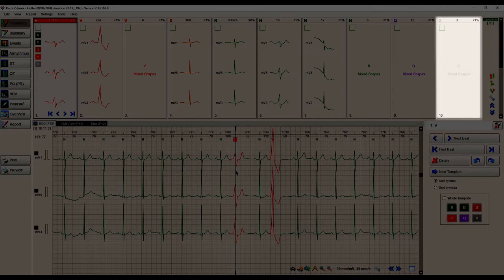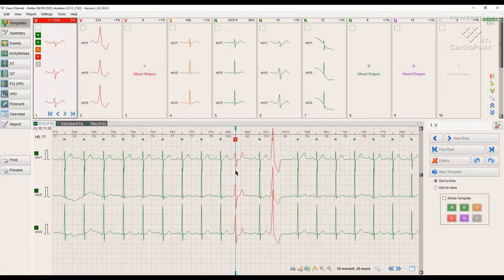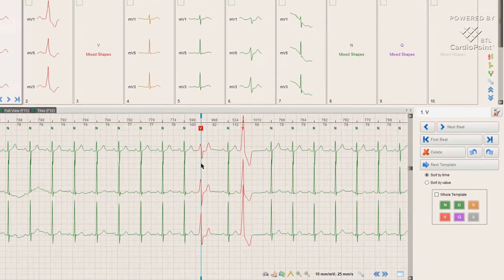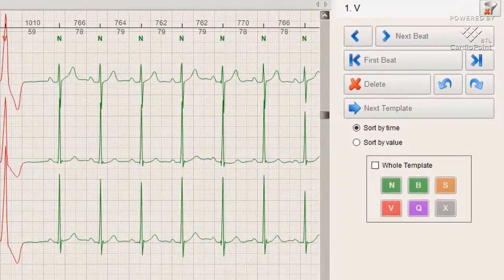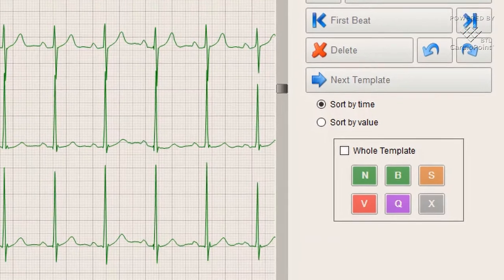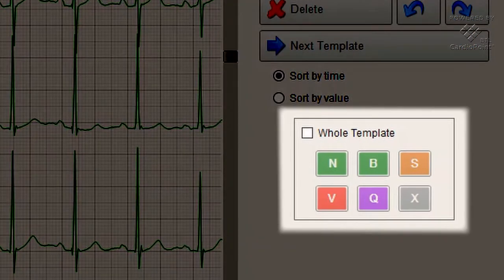The artifacts template contains complexes distorted by noise. These beats will be automatically excluded from the analysis of the recording. Before getting started, let's take a look at the icons used in BTL Cardiopoint Holter.